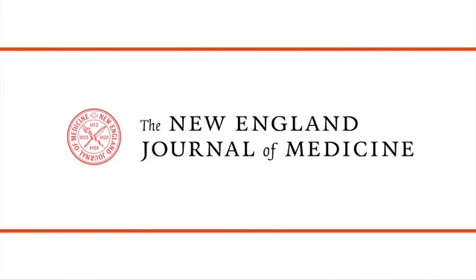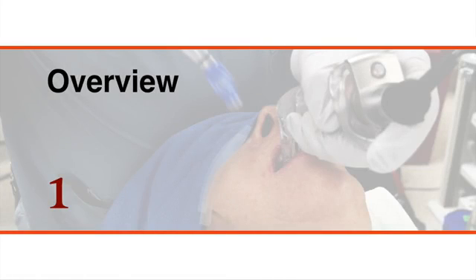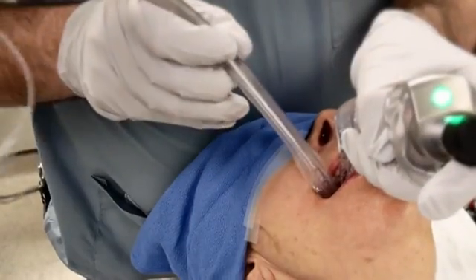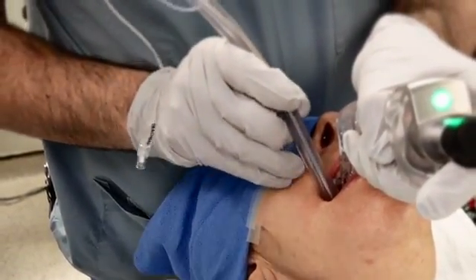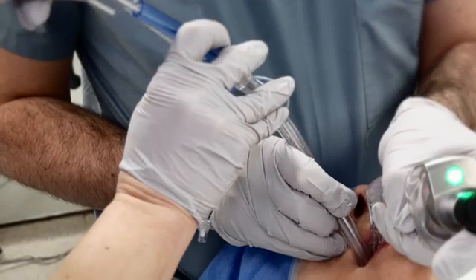This is a video in Clinical Medicine from the New England Journal of Medicine. Placement of a double-lumen endotracheal tube is an airway management technique that permits isolation and selective ventilation of a single lung.